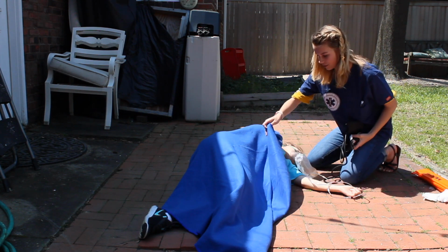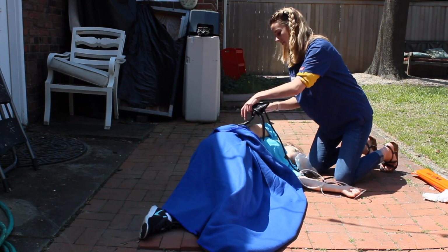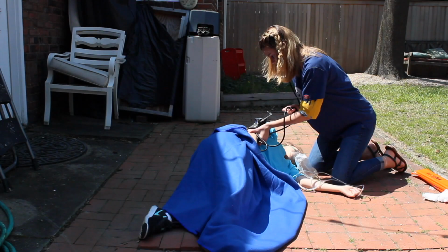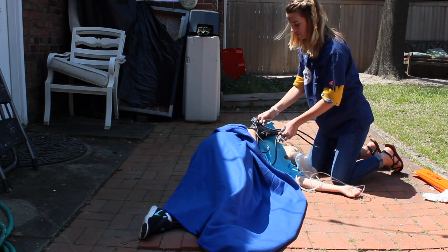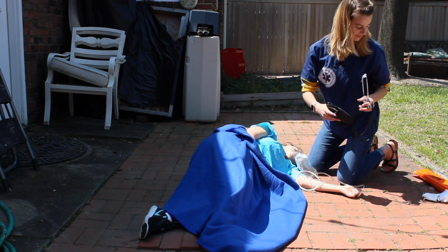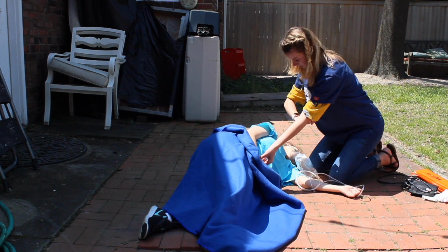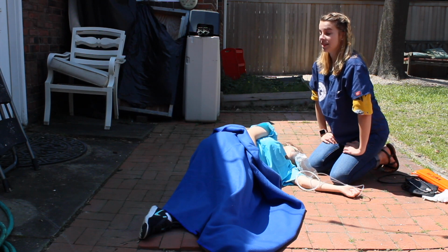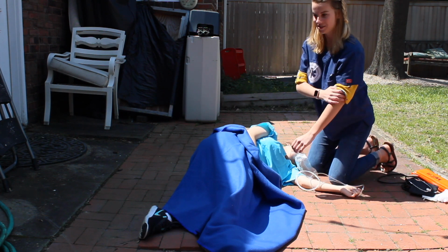So we're going to take the blood pressure on this arm. Okay, her blood pressure is 82 over 56. Okay, it's very low, indicative of shock. And then I'm going to take her pulse and assess her breathing. Okay, her respirations are 26 and her heart rate is 98. Okay, that's also indicative of shock.